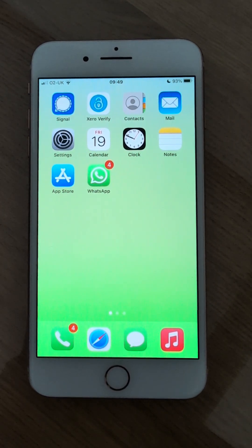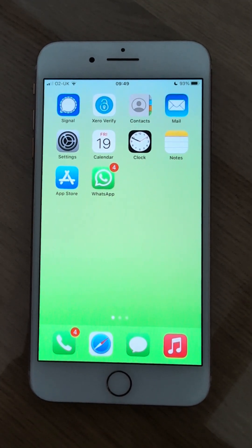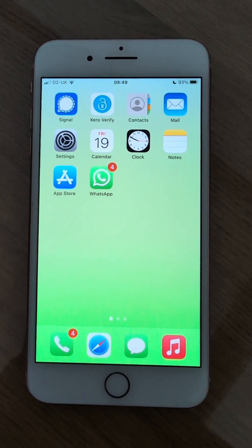Hi, my name is Tricia. Welcome to The Hearing Clinic at Bridget Harley Hearing Care Limited. Today I'm going to show you how to install the Oticon Companion app to your Apple iPhone when you're wearing Oticon Intent hearing aids.